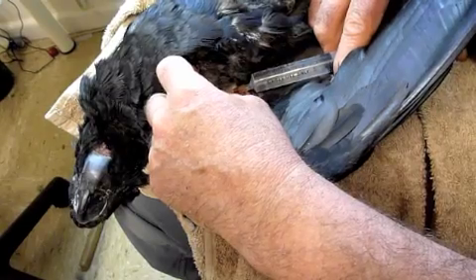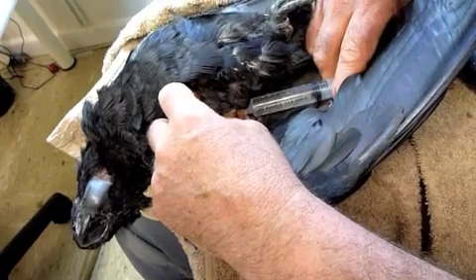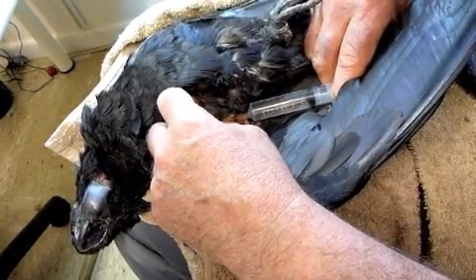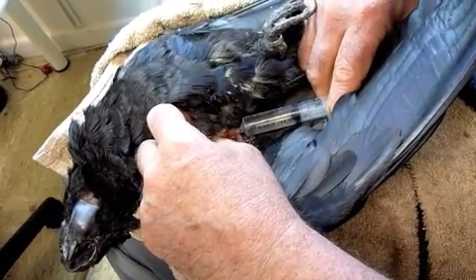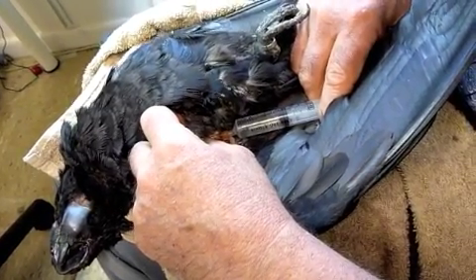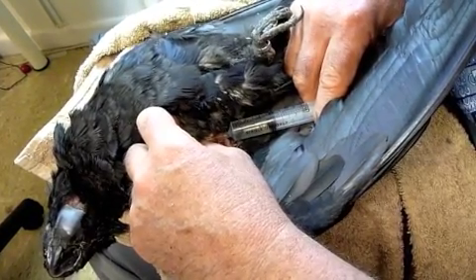Finger off to stop it right now — we're going intravenously. Still going, still going. You see the plunger going down? Still going intravenously.